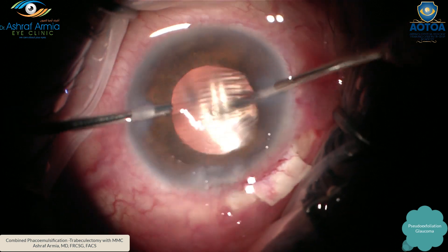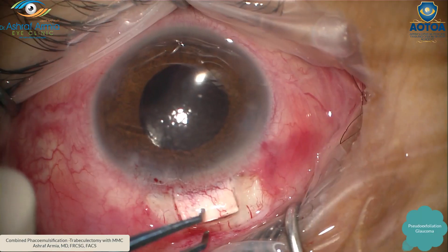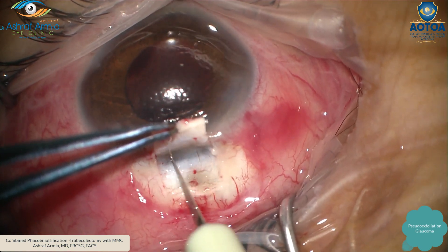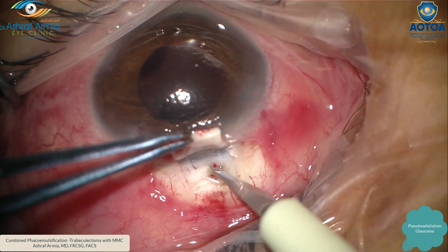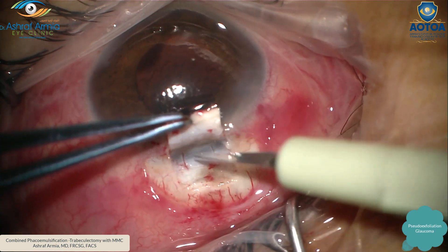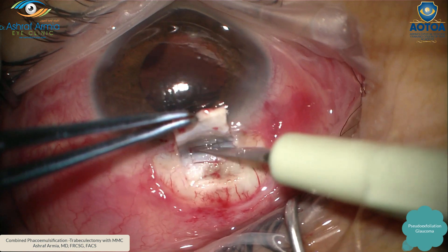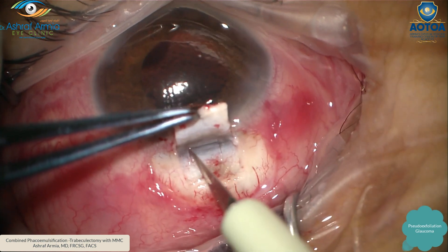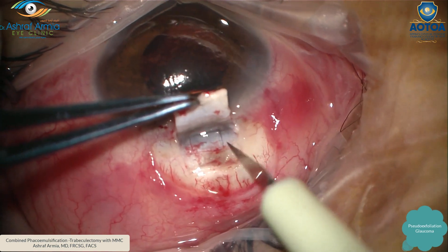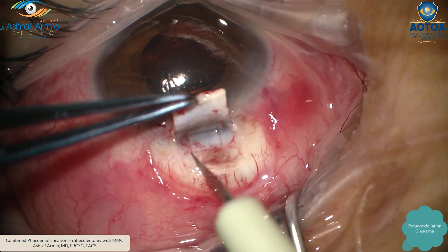Inject cohesive viscoelastic just to maintain the anterior chamber, then perform the trabeculectomy. Make another rectangle — very small — using the super blade. Take your time to make a very nice size with sharp edges. Open first at the cornea end, then the two sides.